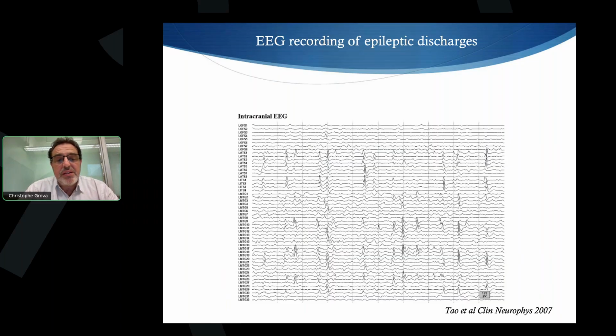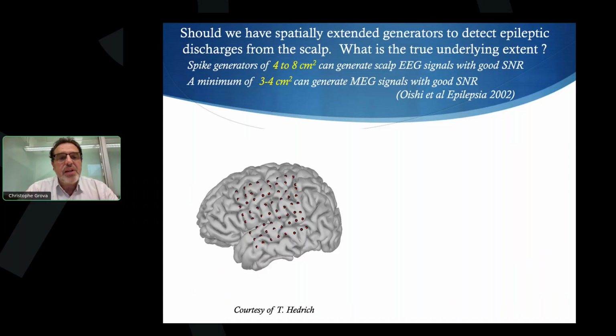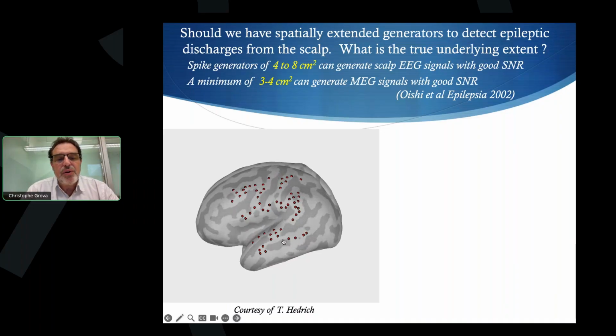There have been different studies, including the one from Tao, showing that we need relatively extended regions of cortex to be active to see those discharges, which are large signal to noise ratio signals on the ongoing scalp data. Typical results suggest that we need at least 4 to 8 square centimeters to see the spike on EEG, perhaps slightly less in MEG, but still it's extended. Those results might not be that accurate, especially because they were compared with ECoG, with grids, not with SEEG, so we're not covering the exact extent of the cortex.